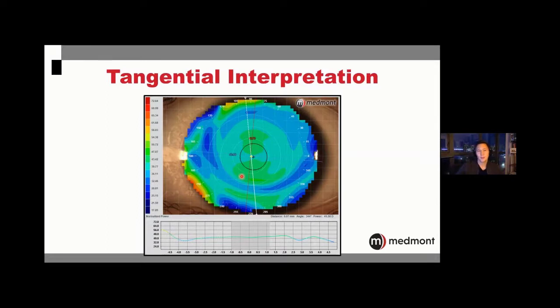And one thing you might look at is that ring, these two arcs that appear in the corneal shape, these flat spots. And that's where your rigid contact lens is landing down and molding the eye shape. So the tangential is very sensitive to areas where we mold. And you might look down on the graph. What sticks out at you on that graph? And you might pick out those 2 points. That's where the contact lens is digging into the eye's surface.